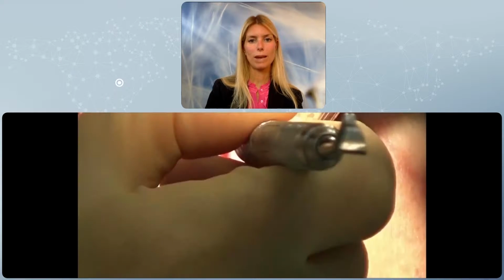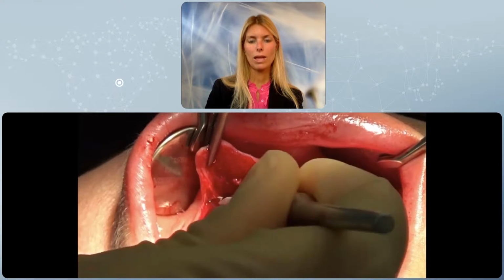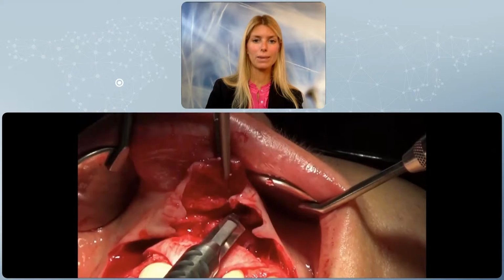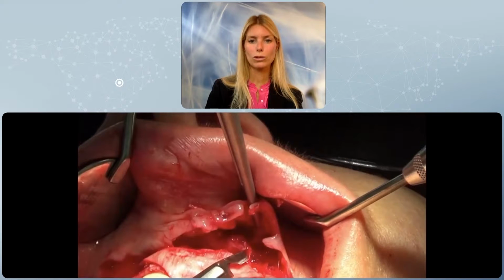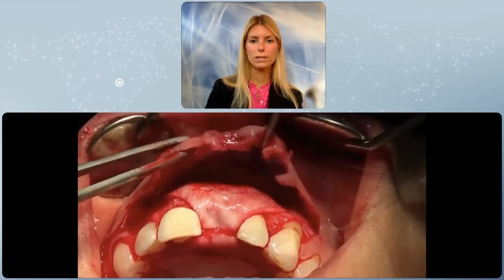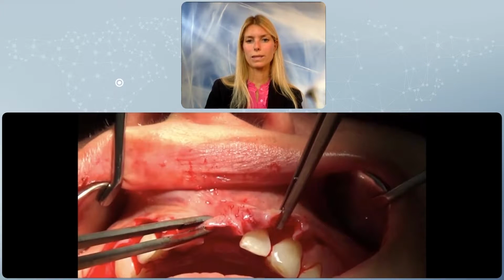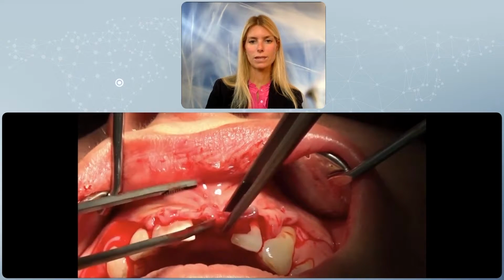As you may notice, the flap has to almost arrive at the incisal edge of the teeth, and this is what we would call a completely tension-free flap, considering that the palatal flap cannot be released by any means. Now, a horizontal mattress suture is always performed. And by the way, the protocol is always the same, whether we're dealing with the anterior aesthetic region or the posterior mandible. We never make up things on the way. We always use the same technique, the same suturing.